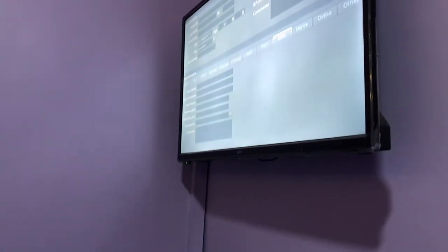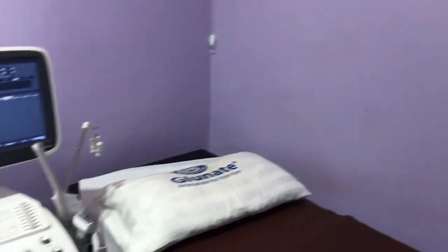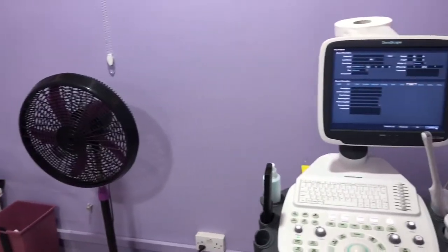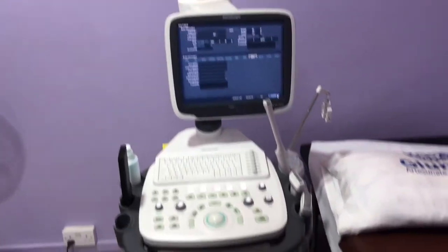And then you put on the probe. This is a monitor or TV screen, so if you are scanning and you want to see what's going on inside, you can look at that screen and you will see it. You also have some tissue over there for wiping your patients when you are done and for cleaning the probe.